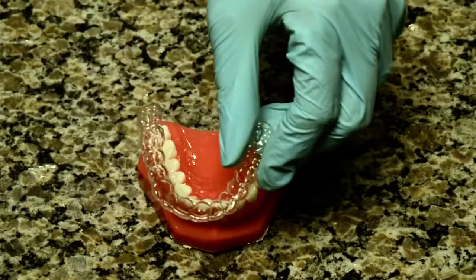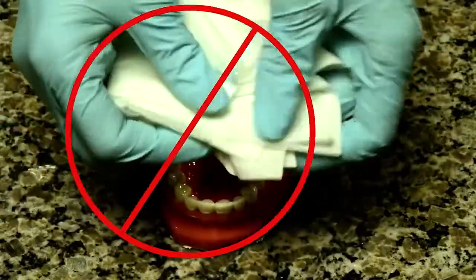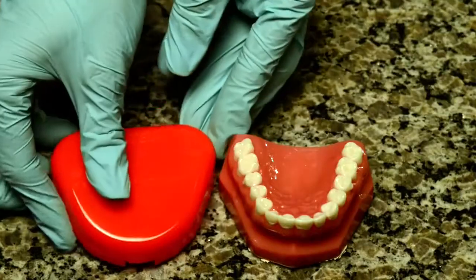Please do not wrap the retainer in Kleenex, as it is not uncommon for retainers to get accidentally thrown out. Instead, always keep your retainer in the retainer case when you are not wearing it.